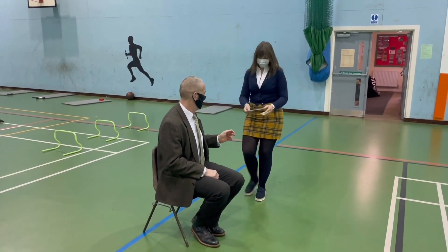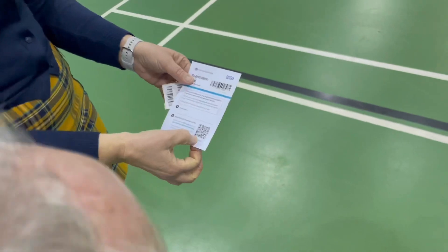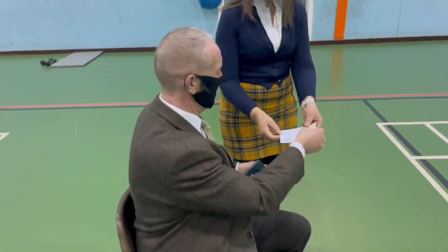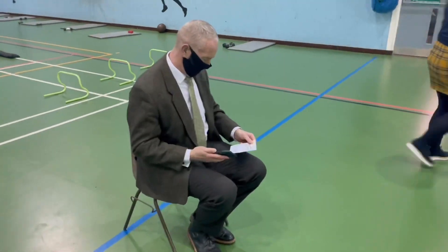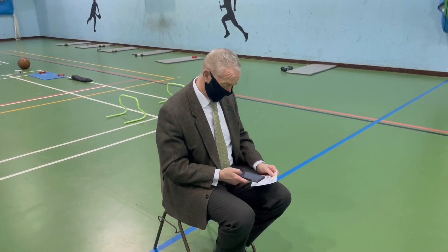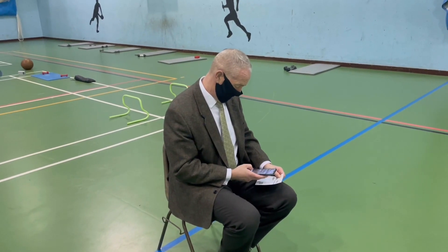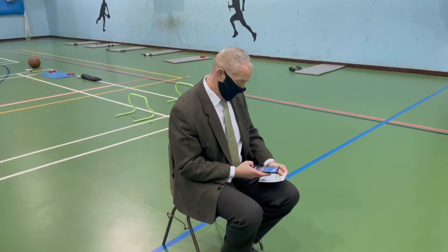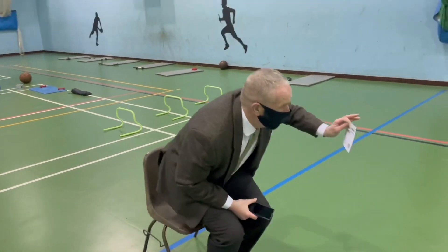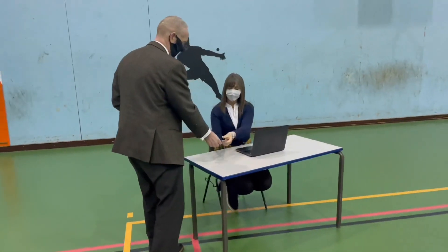There's your registration card — if you scan that barcode it will take you to the website. Our centre code is SQHF. You'll get out a personal device, log on, scan the QR code on the card, and then follow the details to register on the NHS website for your lateral flow test. Once you're ready, you'll indicate by putting your hand up and then you'll be called forward to the registration desk.